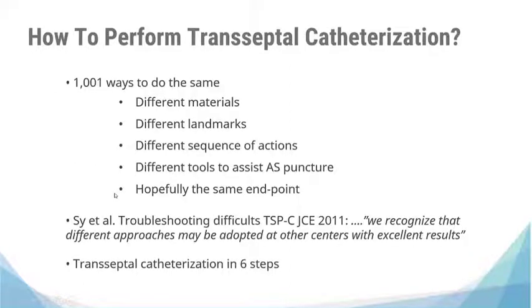There are many ways, more than 1,000 ways to perform transseptal puncture, and they are all right. Every way is good, provided that there is a predefined workflow of action that should be done carefully during the procedure. For the purpose of teaching in our center transseptal catheterization, we subdivided the procedure in 6 steps.